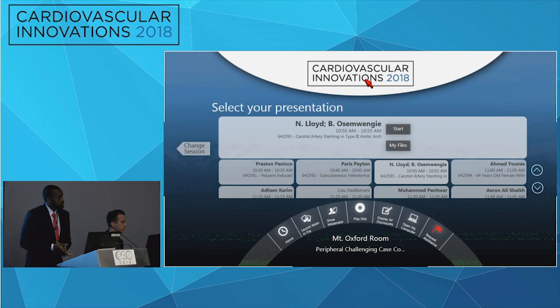I agree. The MOMA tracks fairly well. You don't have to use a MOMA for all your carotids by any means. Most people don't, I would say. But it does track fairly well. You may have been able to get it out there. For all the carotids, I prefer mine. I use one because it gives both proximal and distal protection.